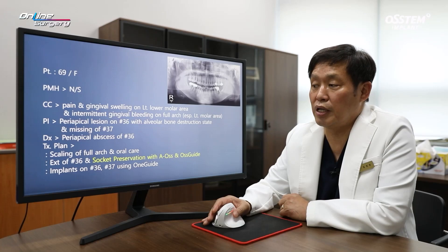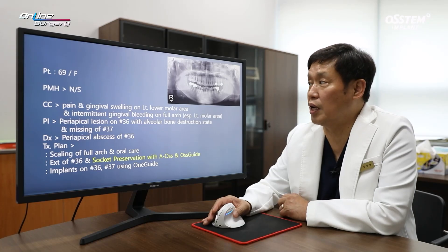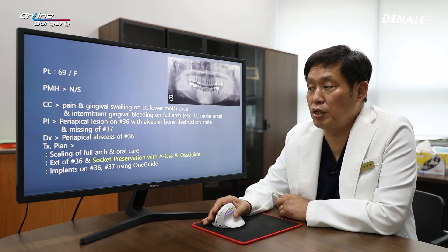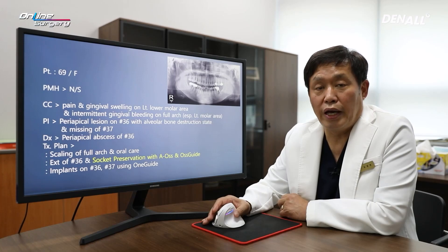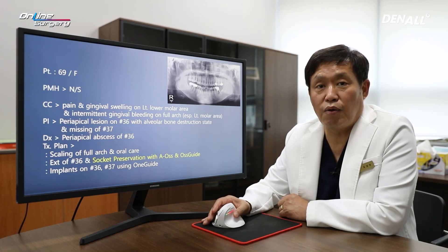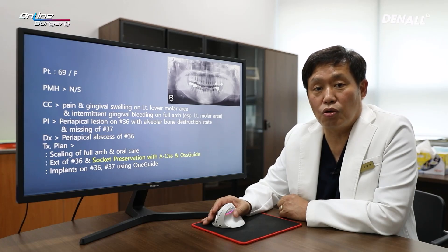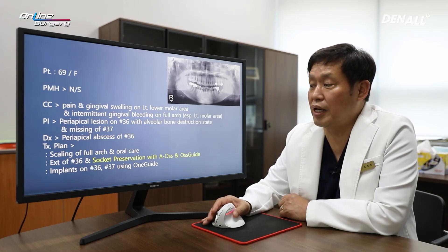One Guide was used to place implants in number 36 and 37. We are currently conducting a study comparing a case where you only use AOS and the case where you use AOS with collagen. We are following up on what kind of findings we get. In this case, AOS was used for socket preservation.